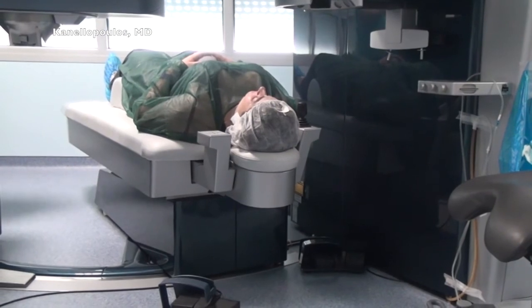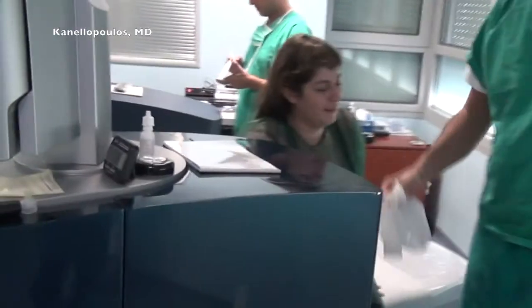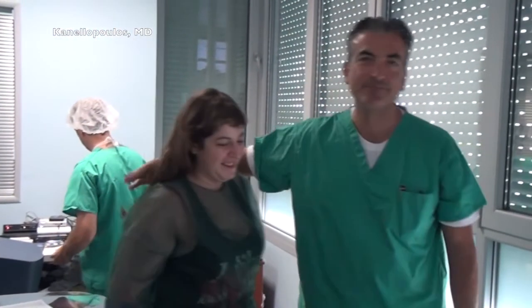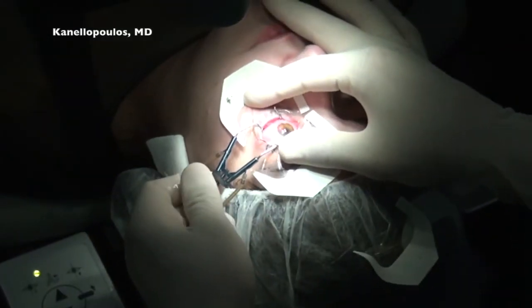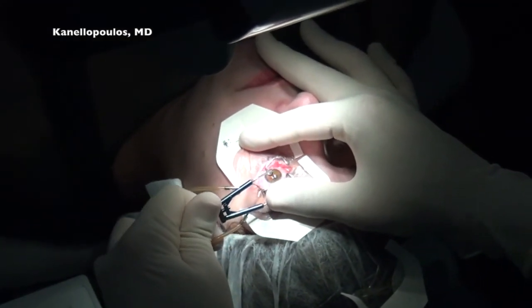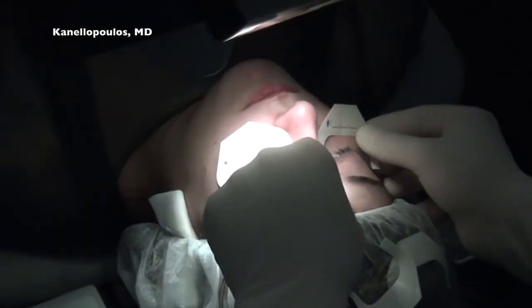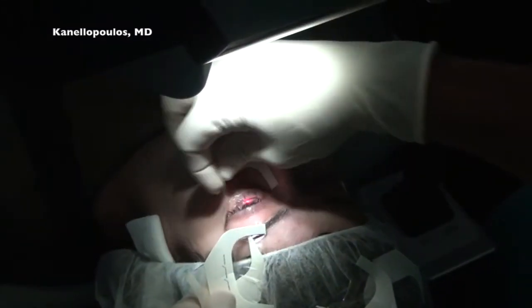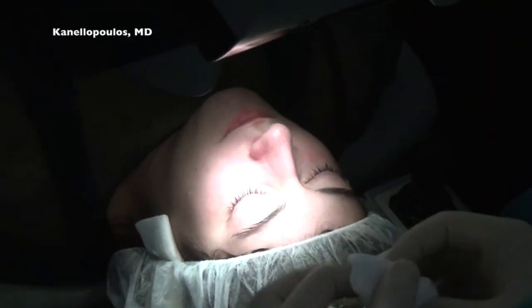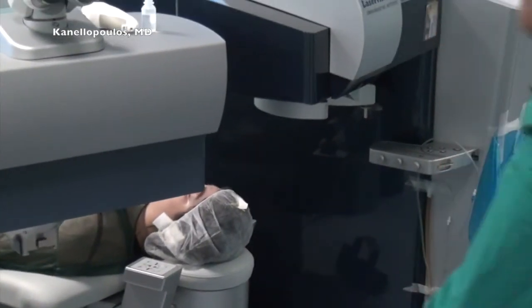We can see the headrest going back into place. We'll have the patient come up. Congratulate her for a great job done. And again, we're seeing how carefully we remove the speculum to avoid any contact of the speculum with the cornea surface, removing the Tegaderm drapes. Carefully dab the surface, and we're all done.